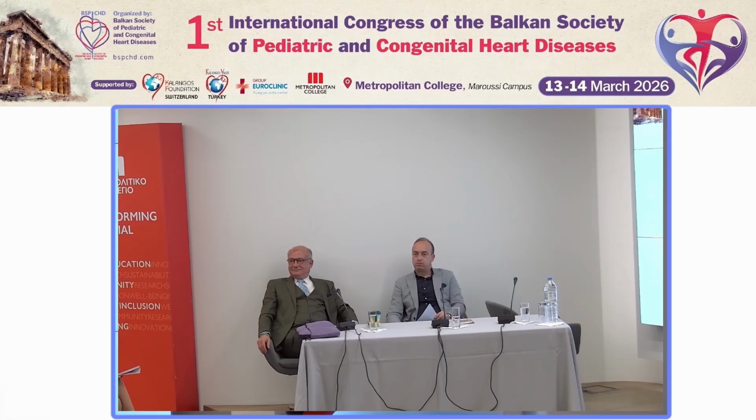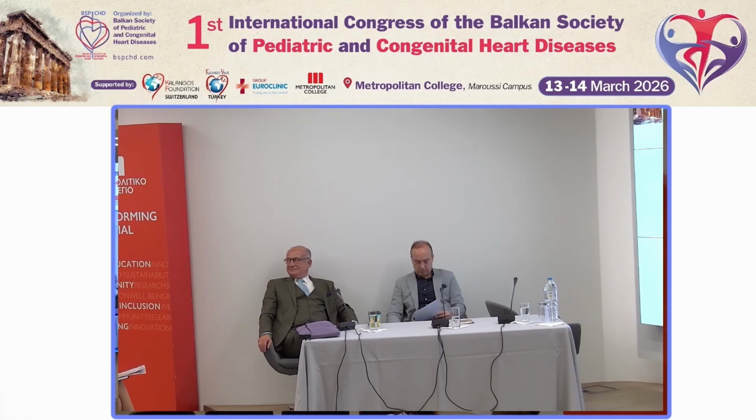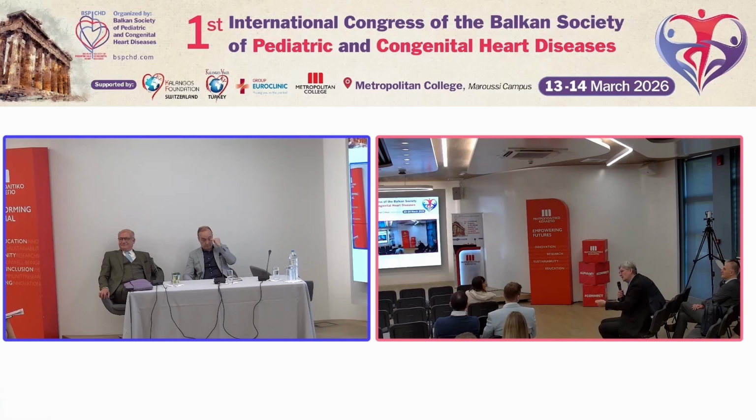And how to treat it, the information is much better provided from the 2D or 3D echo, right? Because you can exactly describe where the problem stands. You can speak to the surgeon, and you can navigate the surgeon even in the theater with the TOE. And we can do the 3D TOE now from babies of the weight of 4.5 kilos.